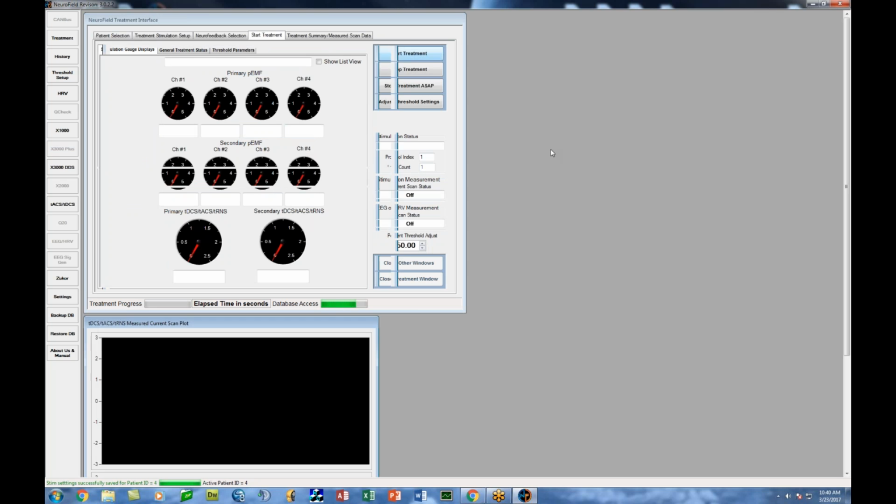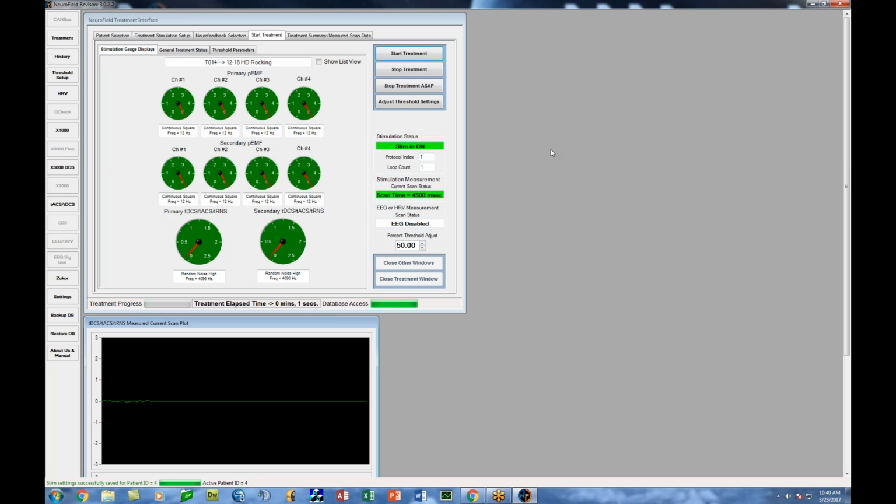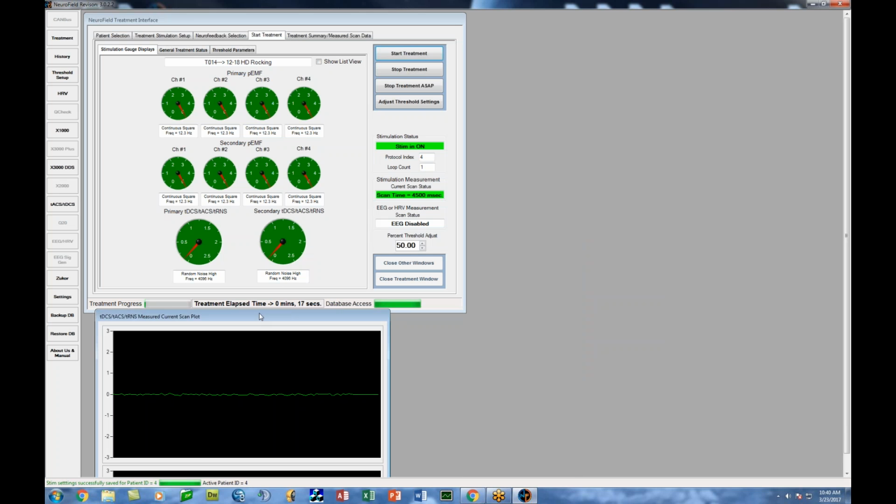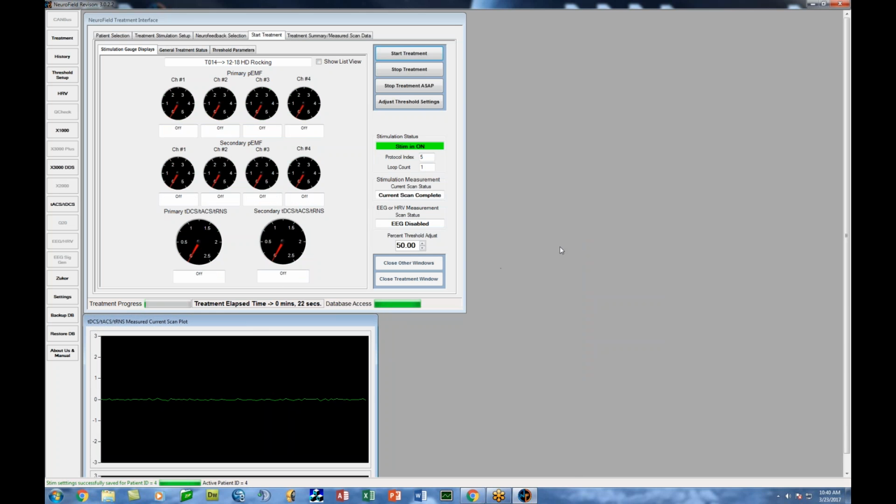Now I'm going to be giving 12 to 18 through my coils, but now I'm giving a real low stimulation with the random noise. And this is what it looks like when you're actually giving something at 0.1 milliamps. It's a real low stimulation, but it does have clinical utility, which is really interesting. Less is more in this case, and a lot of other cases where you don't have to hit the brain with a lot to make a change.